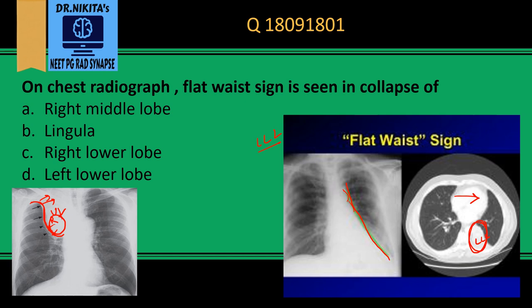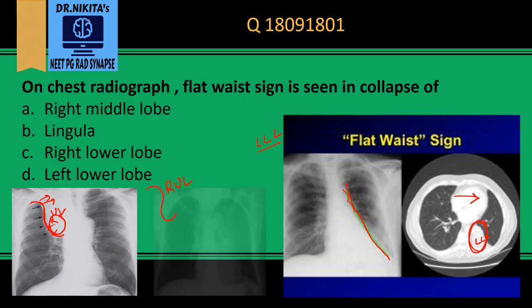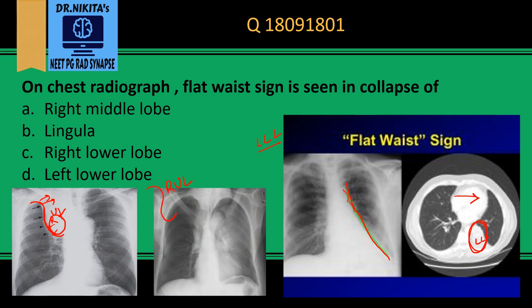This gives the reverse Golden S sign in right upper lobe collapse. The next sign is the Luft Sichel sign — 'luft' means air and 'sichel' means sickle-shaped. As seen here, there is sickle-shaped air surrounding the aortic arch, seen in left upper lobe collapse.